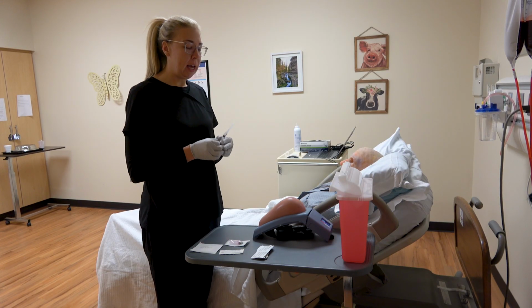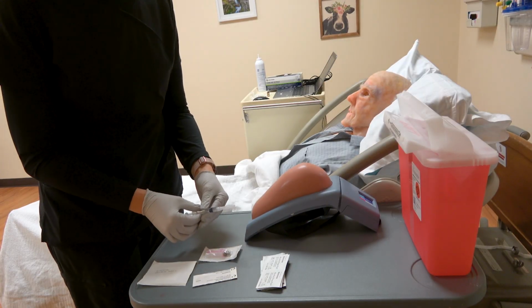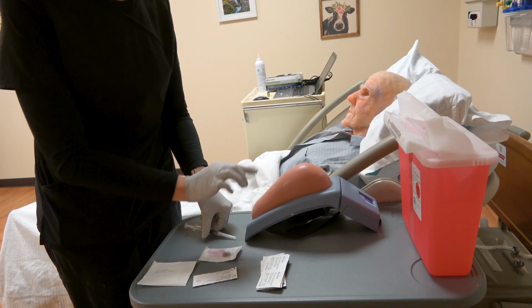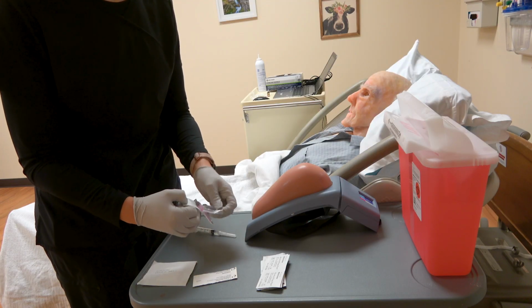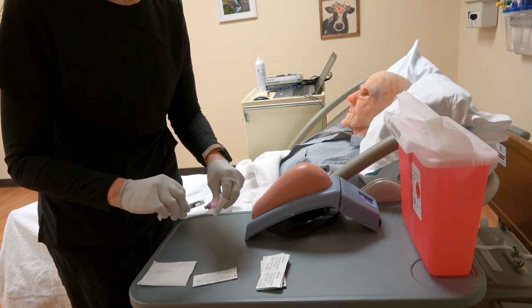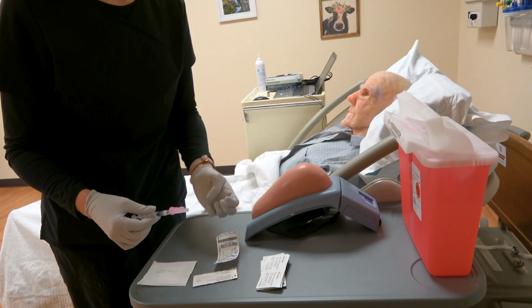So now we're going to go ahead and give our medication. First off, we have to switch out our needleless cannula to the needle that we're going to administer the medication with. If you don't have a needleless cannula available, you can use 2 different needles. But we had a needleless cannula, so we're going to go ahead and attach that right there.